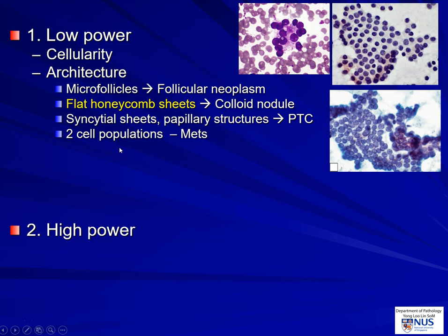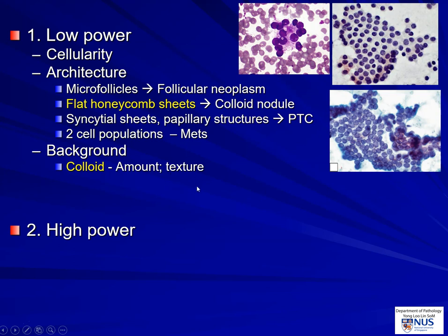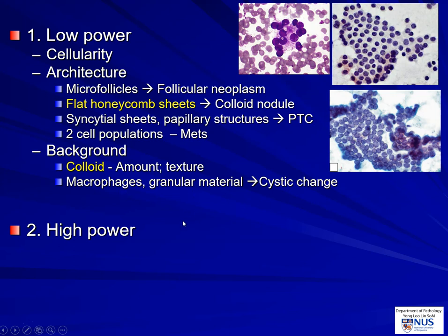If we see two cell populations with the native follicular cells, which are quite small, and another population, we think of metastases. For the background, of course it's colloid in terms of the amount and also whether it's thin or thick. A very thick colloid can be seen in some tumors, particularly papillary thyroid carcinoma. And if we see anything that indicates a cystic nodule, such as macrophages or granular proteinaceous material — and don't forget to look for lymphocytes, especially if you have an oncocytic or Hürthle cell population, because there may be lymphocytic thyroiditis.